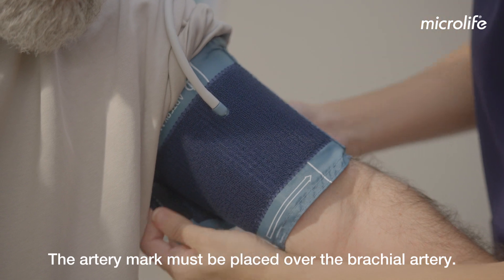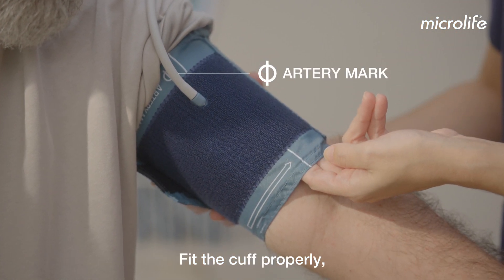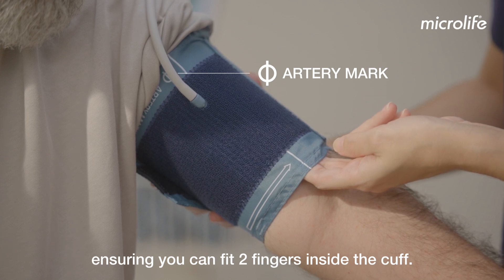The artery mark must be placed over the brachial artery. Fit the cuff properly, ensuring you can fit two fingers inside the cuff.